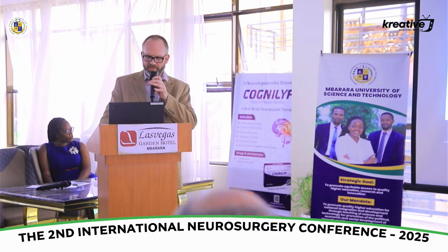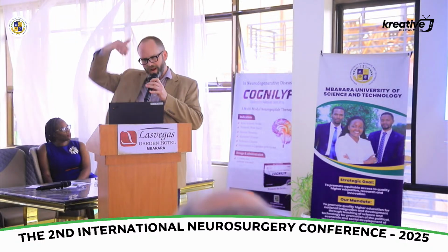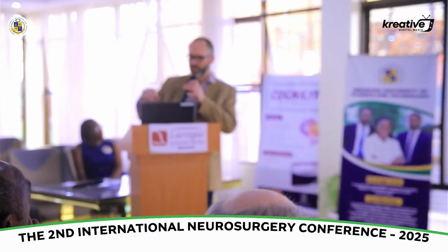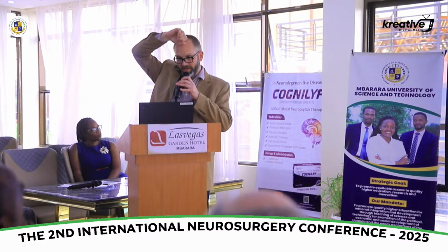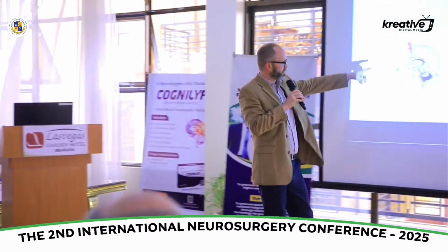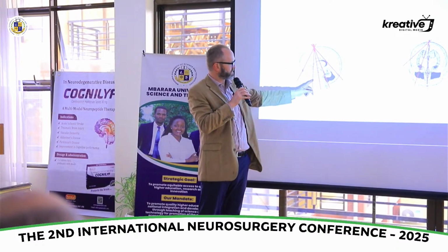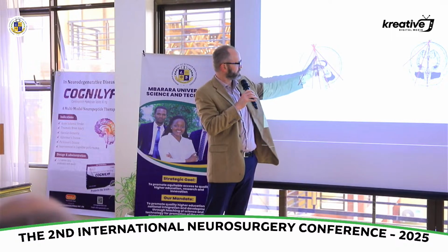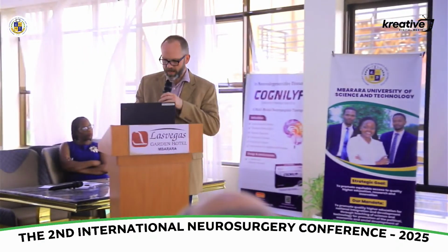So if we think of the anterior fontanelle, you're going to have two images. You're going to have a sagittal or a coronal view, and there's a direct coronal, but then if you want to see the whole brain, because you just have one little window to look through, what they do when sonographers look at infant brains, they have very specific views they look at. It's easier to show here, where first you go through the frontal lobe down to the orbital roof, then you come back through the lateral ventricles at the anterior commissure, at the optic chiasm, then back at the anterior commissure, and then back to see the brainstem and the cerebellum, and then finally get a posterior one, entire neonatal brain.